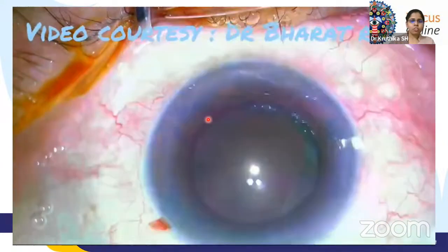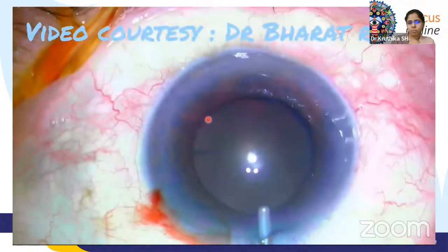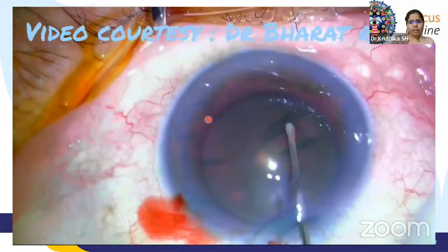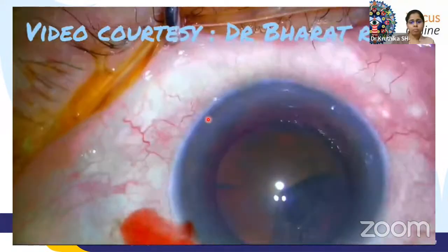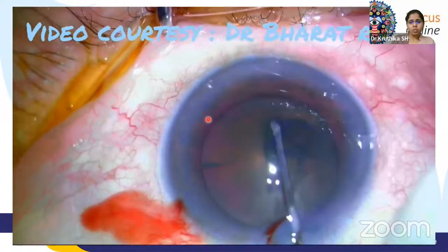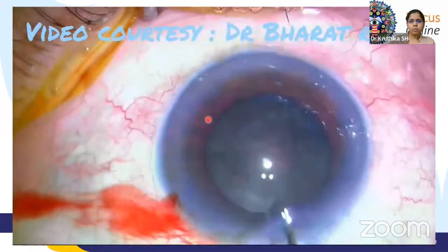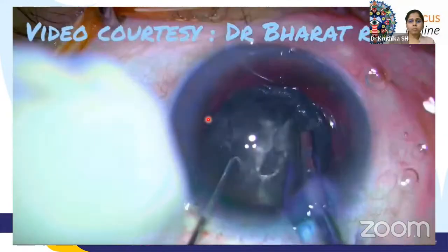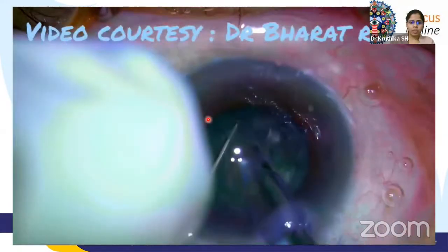This is a surgery done by Dr. Bharatratna sir, a senior consultant at Center for Sight Eye Hospital. This is a patient who is undergoing cataract surgery in a silicone-filled eye. Silicone oil was placed in this patient for retinal detachment surgery. Once the retina was stable, the patient was planned for cataract surgery along with the removal of silicone oil. As we can see in this case, routine phacoemulsification is being done.